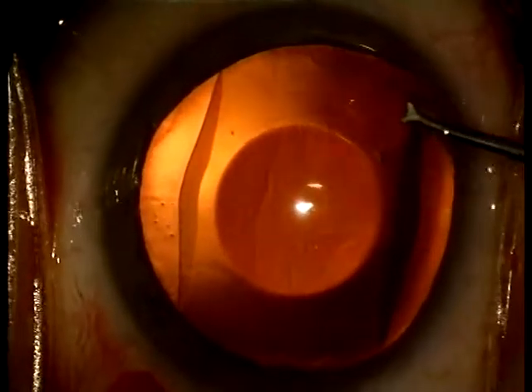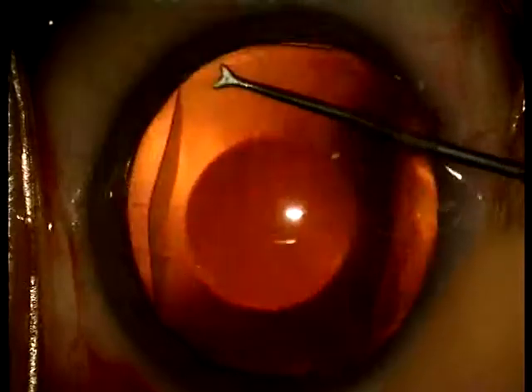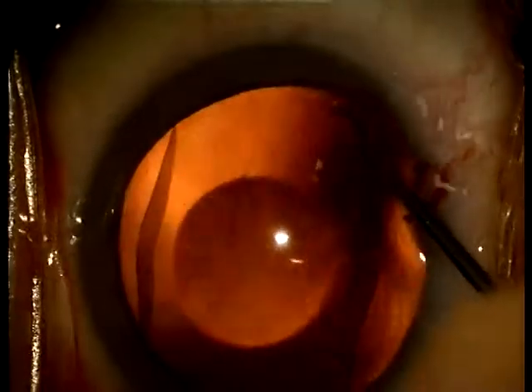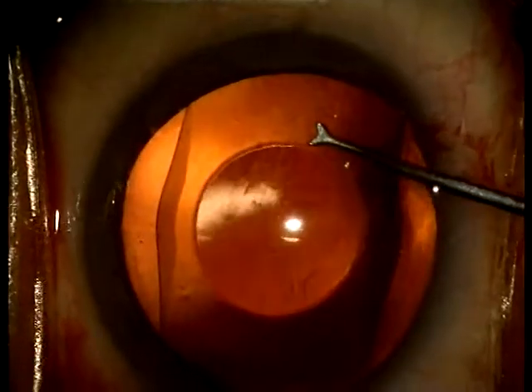Through the paracentesis, the distal haptics are then placed under the iris. Do this very gently and try not to touch the iris or crystalline lens.